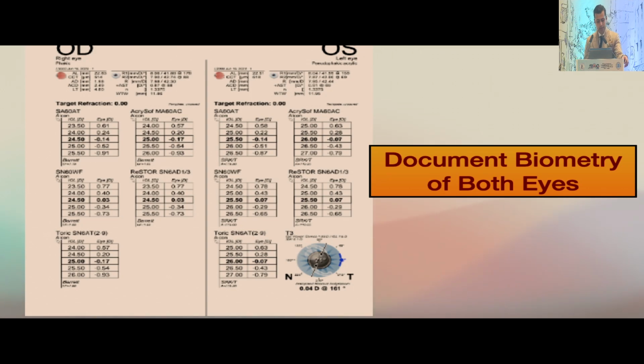I also do biometry of both the eyes for many reasons, including the fact that they may develop cataract later, and it's good to have the biometric status. But one thing that I've started to look at in the new OCT biometers is also the configuration of the iris, because the posterior bowing iris in my hands has given rise to a lot of post-operative pigment dispersion.